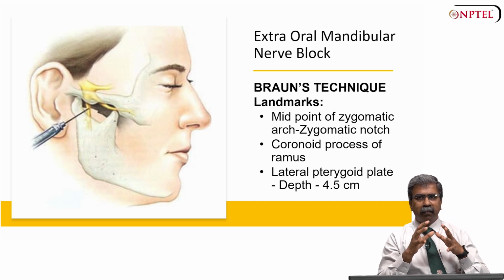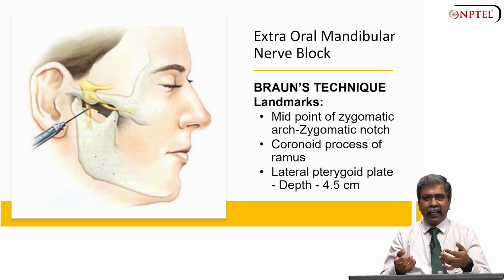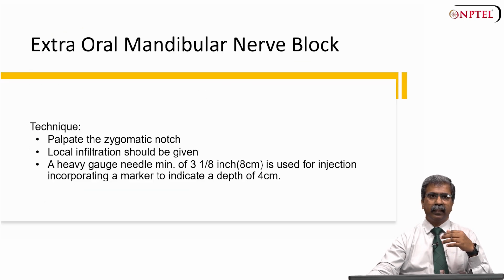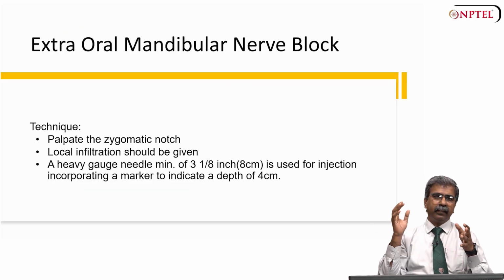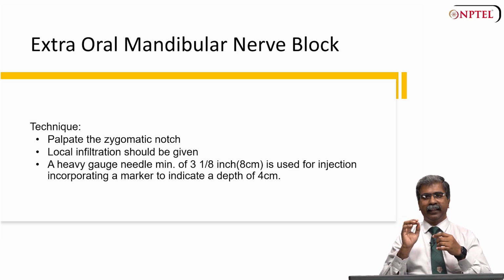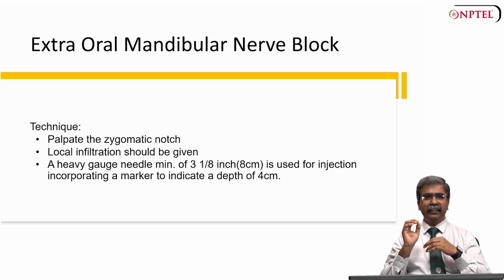By pinpointing these landmarks, dental professionals can accurately administer anesthesia to the inferior alveolar nerve, ensuring effective numbness for dental procedures. This technique is particularly useful in situations where intraoral access is limited, or when deeper or longer lasting anesthesia is required. Palpate the zygomatic notch. Local infiltration should be given prior to the nerve block at the identified area, to minimize discomfort associated with the injection.